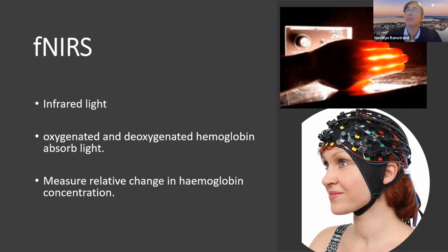And the fantastic thing about this is that it's relatively easy to put on. Generally, I could probably put this on someone in 15 minutes with explanations. It's relatively stable, so it can be used dynamically. I throw a tablet in a backpack that the person wears.